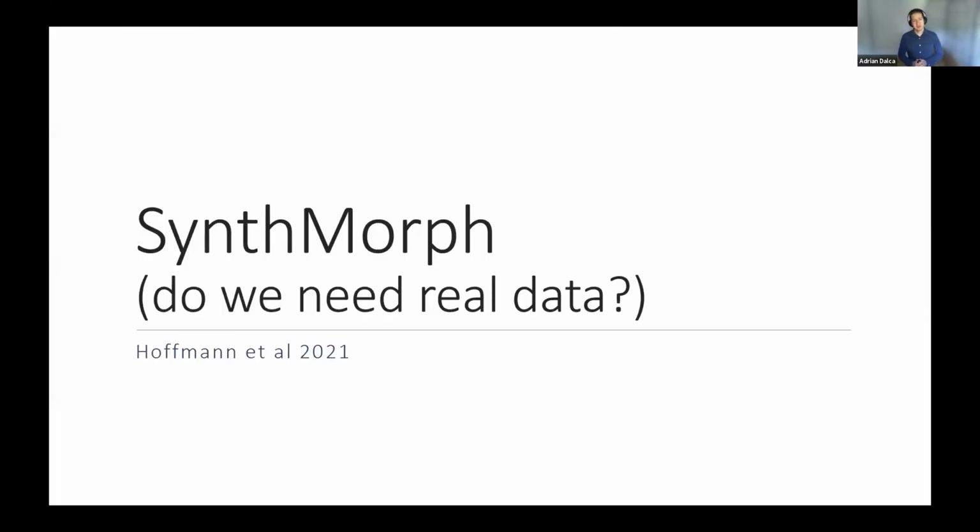And that's how we came up with this project called SynthMorph. The idea was, could we synthesize the variability that we don't care about? In particular, could we synthesize images of such different contrasts, of such crazy, maybe impossible contrasts, that we teach the network to not focus on the actual contrast, but instead to try to extract the anatomical structures underlying the images. So let me show you what I mean.